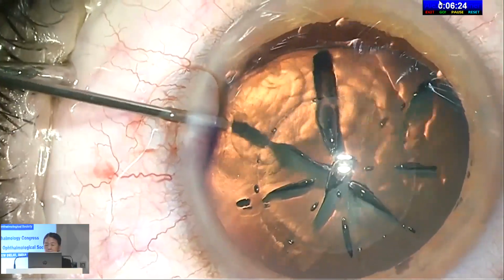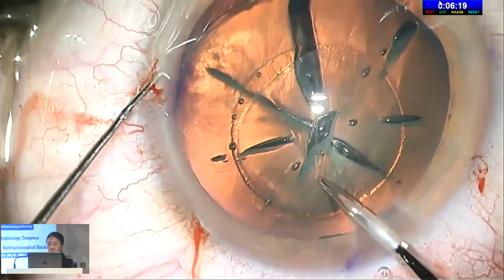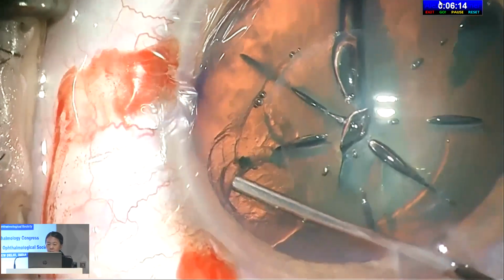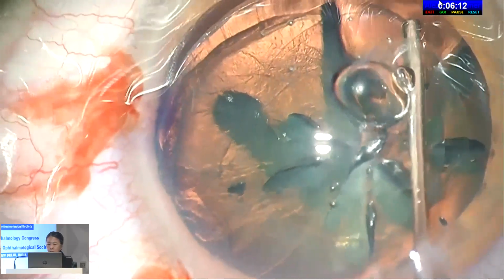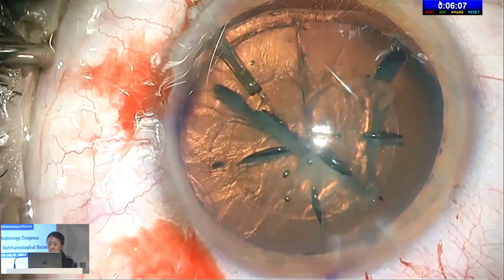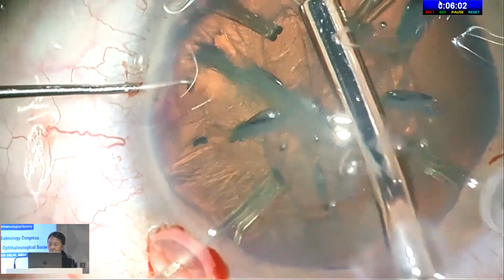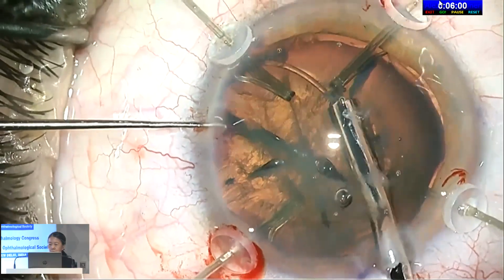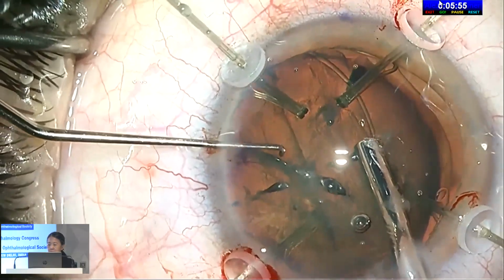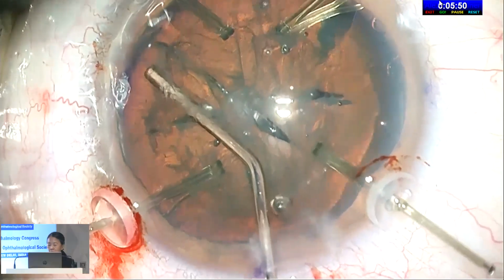So you can see here on the table, first thing to do is to make sure that I don't get vitreous coming forward, so I inject the dispersive viscoelastic to fill up the gap that's actually present between the zonules and the rest of the eye. And very important step after removing capsulotomy, I place my hook and dissect the plane of viscoelastic just under the anterior capsule, and you can see that this needs to be done 360 degrees around, and you can insert that CTR into that clean plane. All right, you can see it skirting around, and that's not trapping cortex.